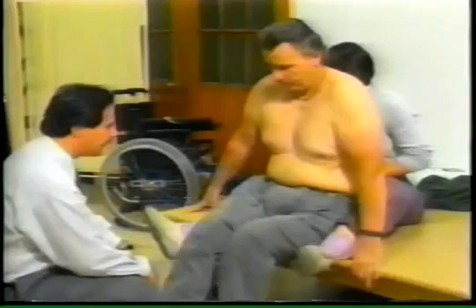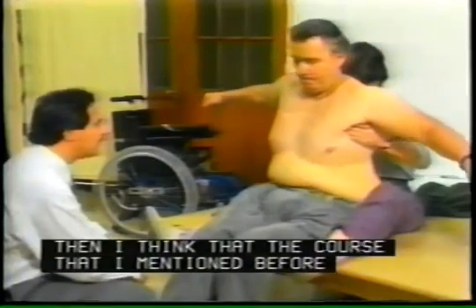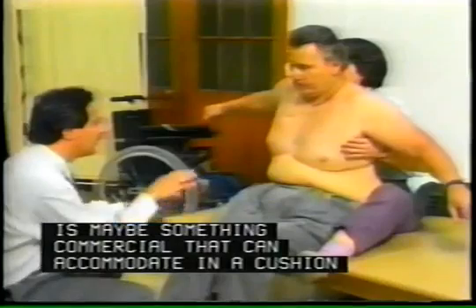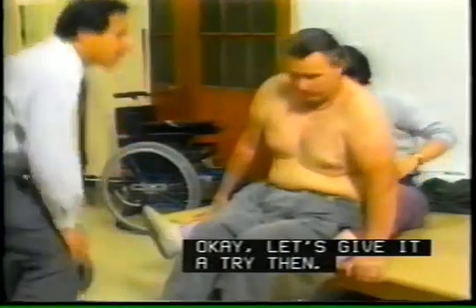Let's see if I give him... I need to lift this side up? Is that okay? Yeah. If I give him some support there, now lift your arms up, Steve, then I don't have to work quite so hard in the trunk. Then I think the course that I mentioned before was maybe something commercial that can accommodate in a cushion for the obliquity in his hip, maybe a good starting point. Okay. And then maybe look at something to stabilize his trunk. Okay. And I think linear would probably work well. Okay. Let's give it a try then.